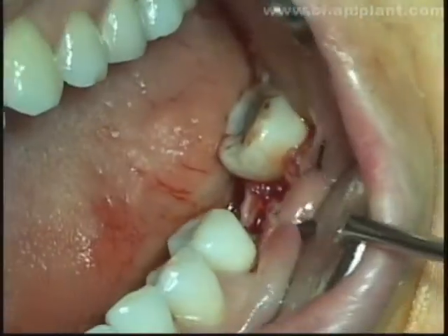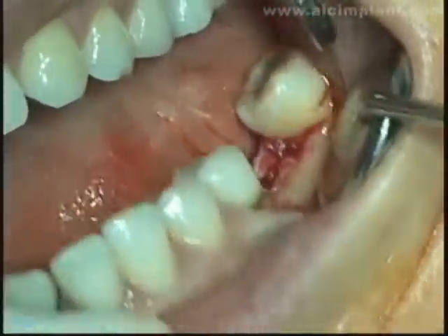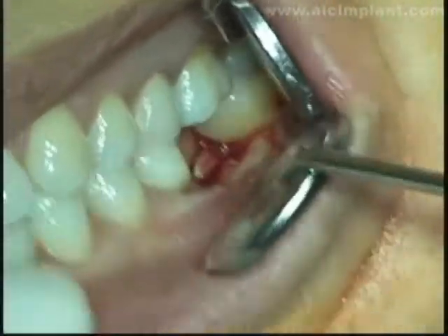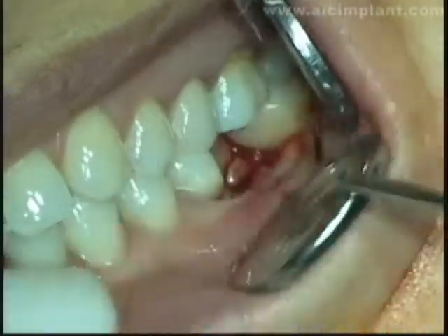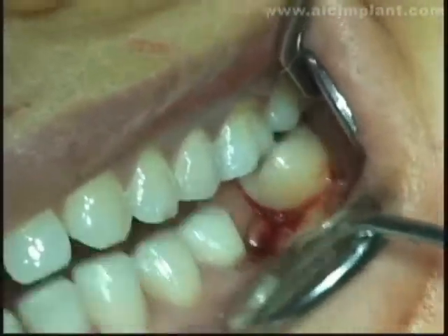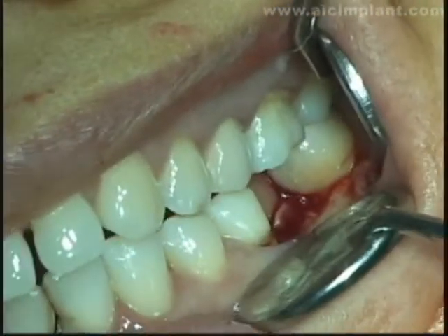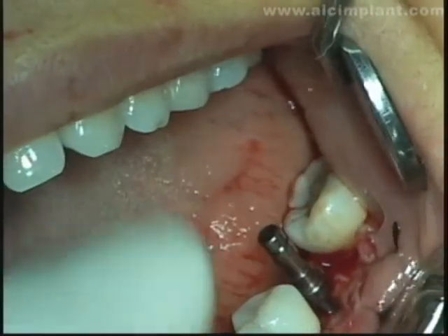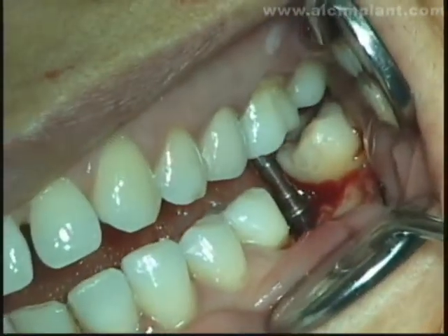Checking the mouth opening pattern of the patient before the surgery is also recommended. This is because there are cases wherein the patient senses the parallel pin. As such, she cannot chew normally. I think this direction is the habitual chewing pattern. It is nearly within the functional cusp.